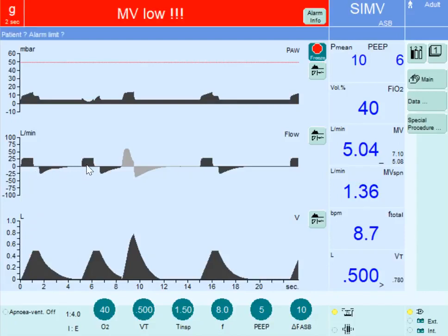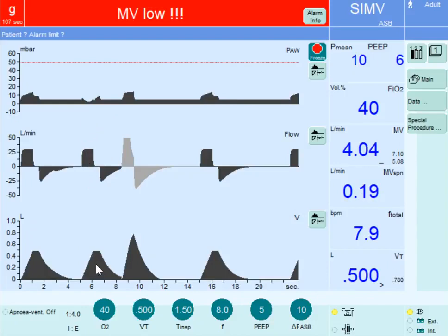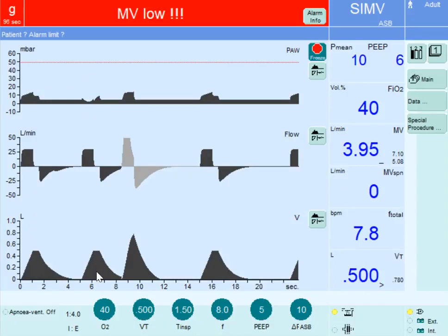The second breath occurred in the supported or synchronized window. The patient made an inspiratory effort, so the next mandatory breath was given slightly earlier with the same control — a tidal volume of 500 ml. Notice the flow is similar to the previous breath. This is a controlled or mandatory breath — specifically a synchronized breath. The breath after that occurred in the supported window, where the patient's effort was supported with a pressure support of 10 centimeters of water.